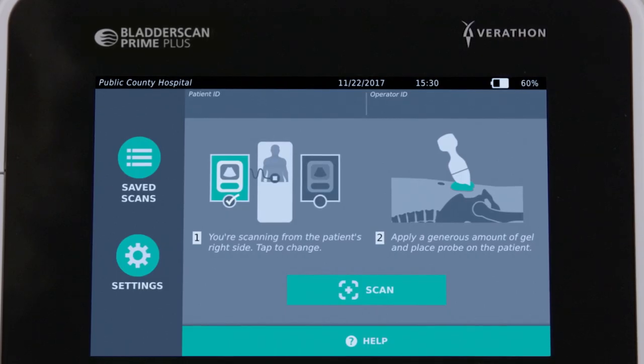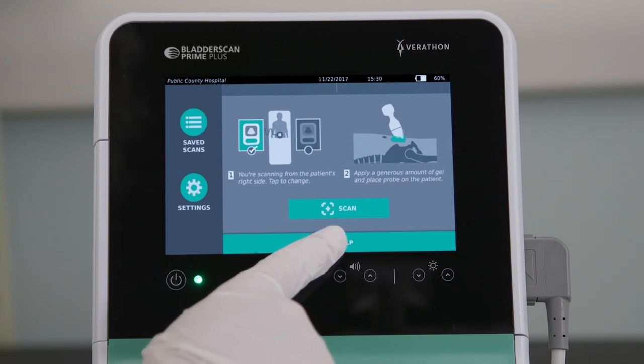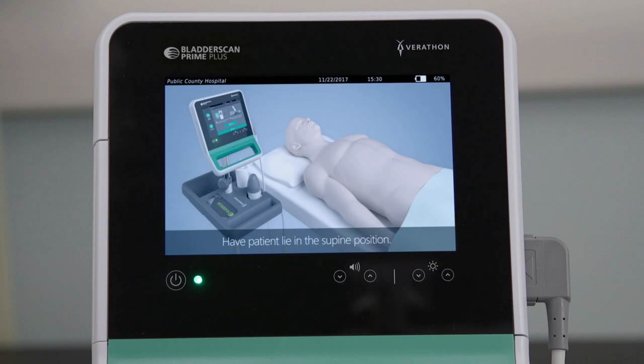The BladderScan Prime Plus includes an onboard tutorial, and we recommend reviewing the full tutorial before using the instrument. To start the tutorial from the home screen, press the help icon on the console's touch screen. The entire tutorial will play. If you start the tutorial from any other screen, it will begin from that screen.